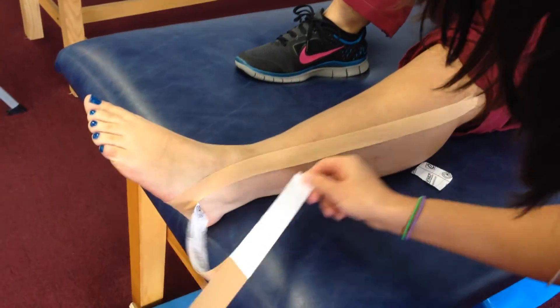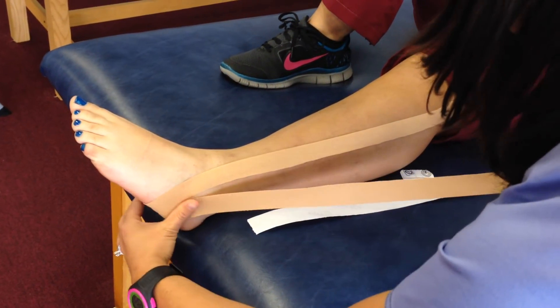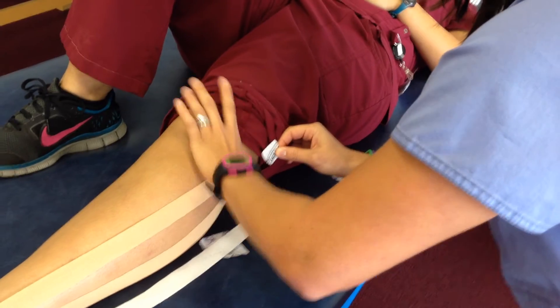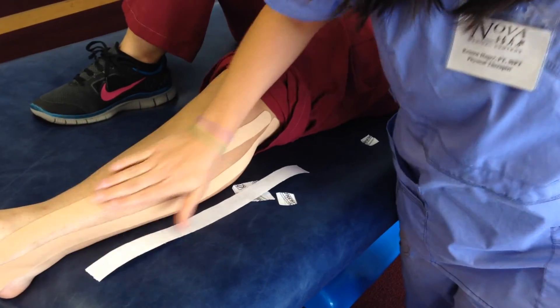Same thing on the other one. It's just a peel and stick technique — there's really no tension in the tape. Make sure you rub it to activate the heat.